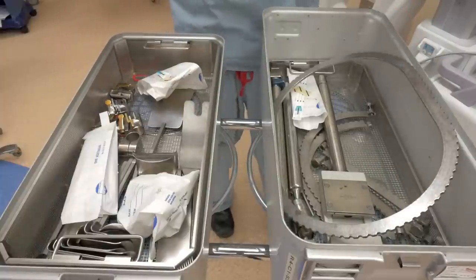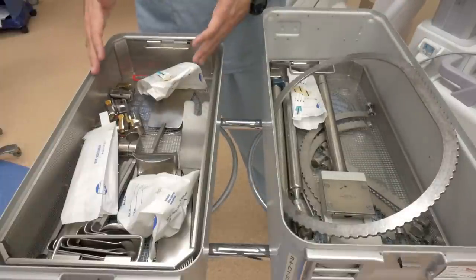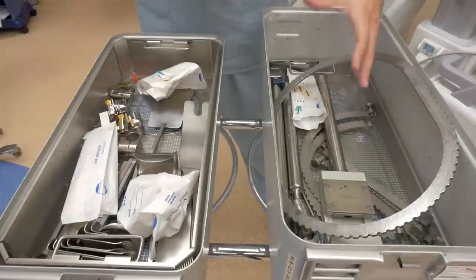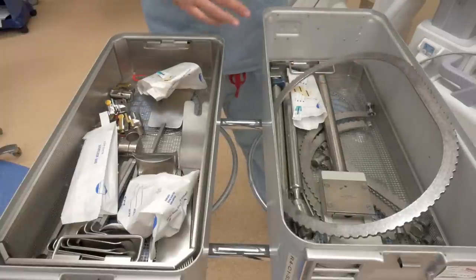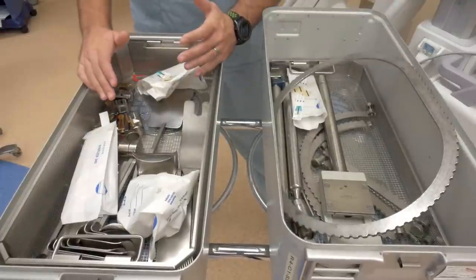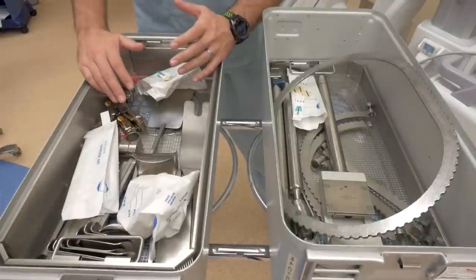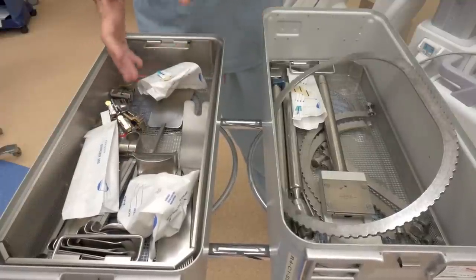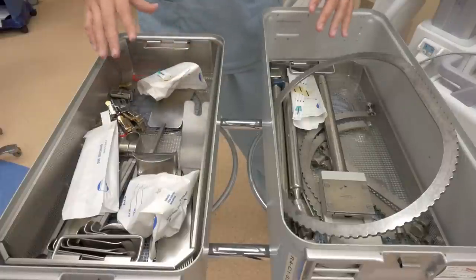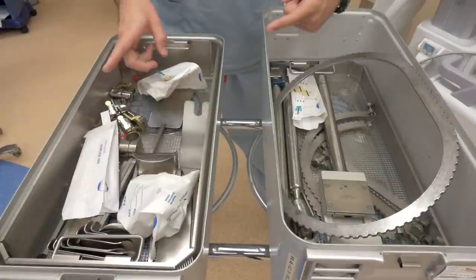Now the Bookwalter set is huge — it's a lot of pieces. It comes in two trays here at my hospital. We have one tray for the table mount, bars, and rings used for the system. And on our separate tray we have all of our ratchets and blades of different sizes to be utilized on the ring itself. Now let's go over individually what and how all of these things come together on the field.